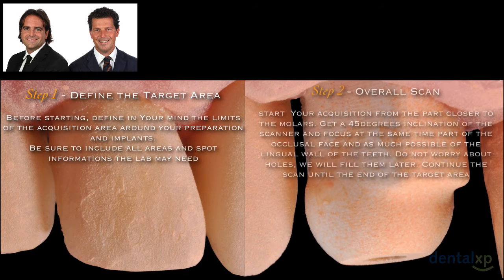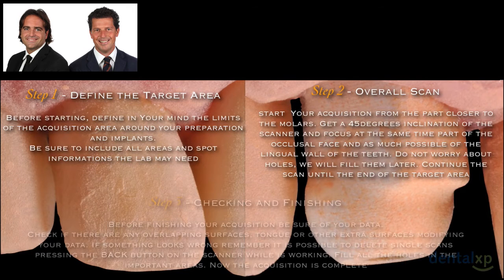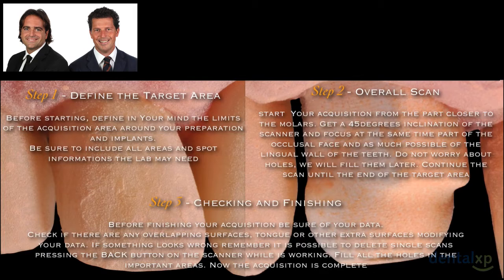In the second step, that we call the overall scan, we start our acquisition, and we do some smooth, nice and easy movement. We're not going to worry about black holes, because those are the holes that in step 3, which we call checking and finish, are going to be closed.